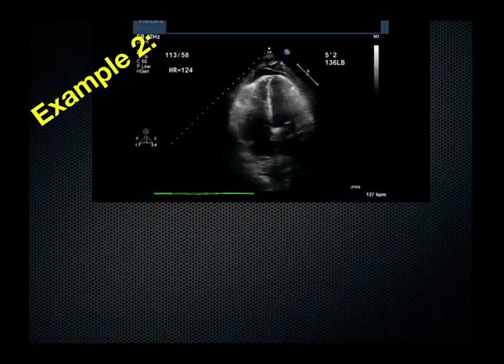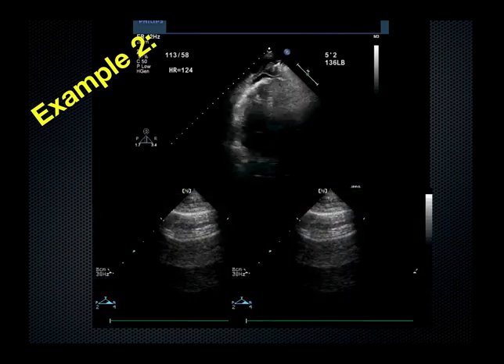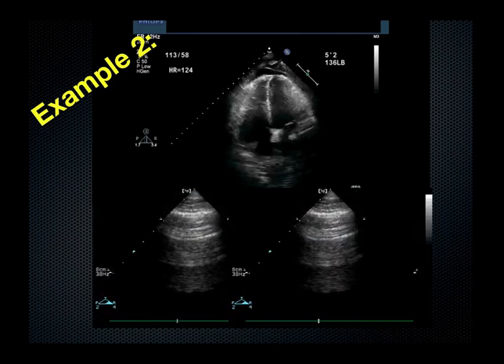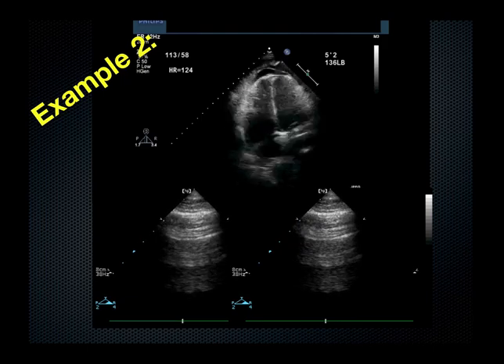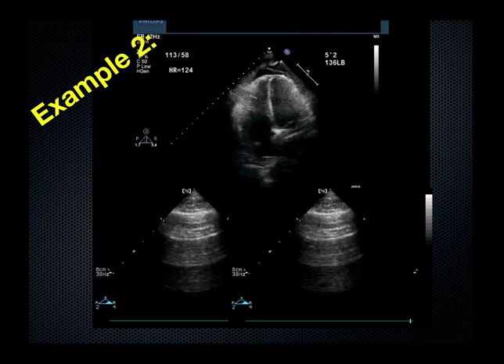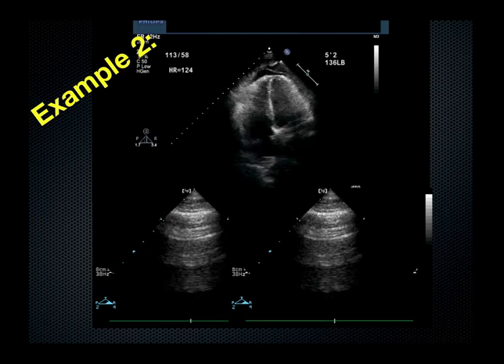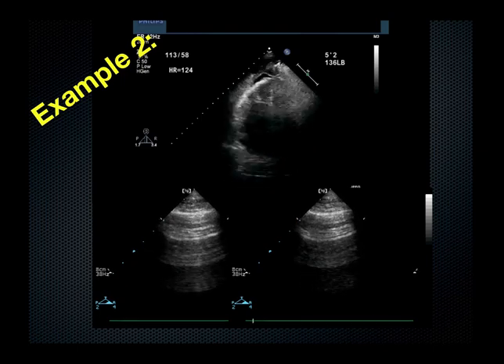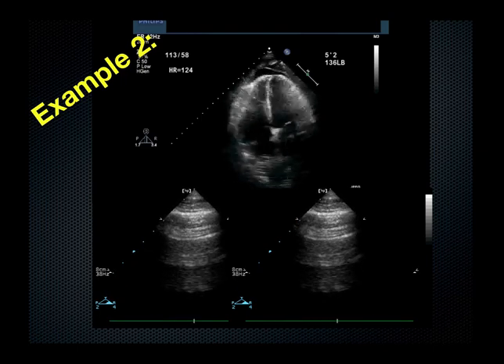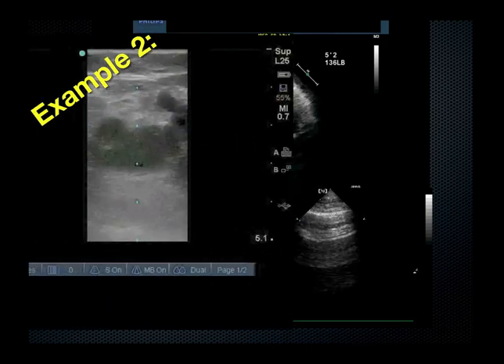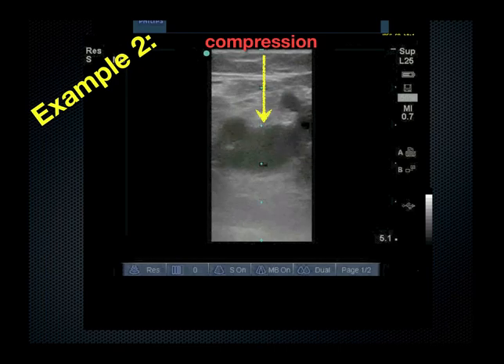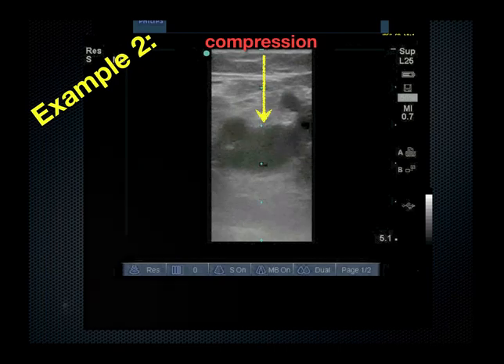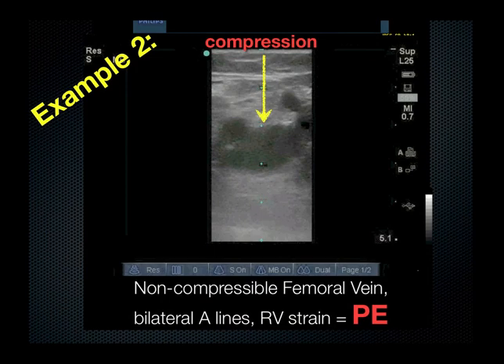Another example: patient is short of breath, and what we see is a very hyperdynamic heart with a little bit of right ventricular enlargement, and bilateral A lines. What is the diagnosis that can combine right ventricular strain and normally aerated lungs? If you're thinking PE, then you're thinking correctly. Look at the legs, place compression venography — if you cannot compress the vein, then you are looking at PE.